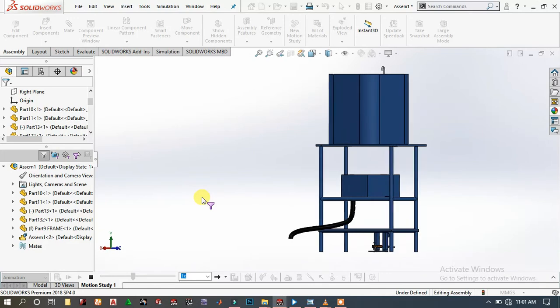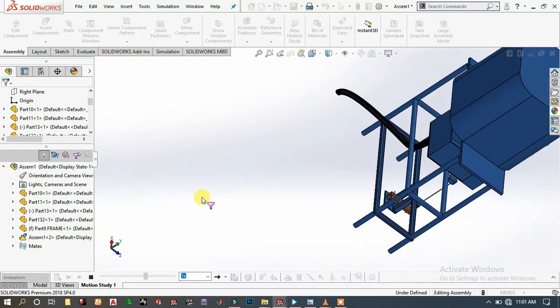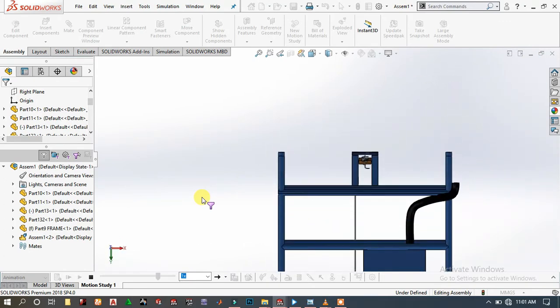Here is the final animation of these handles. I think you enjoyed it.